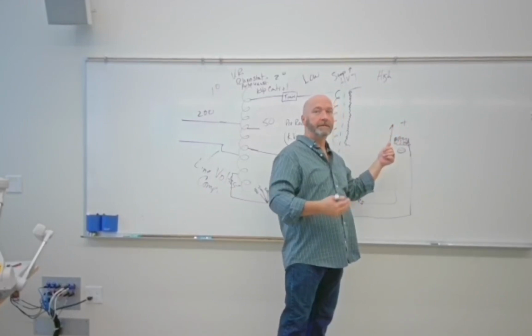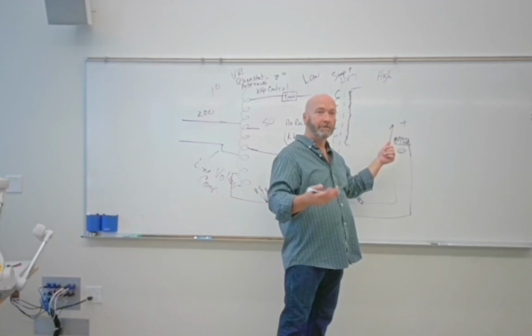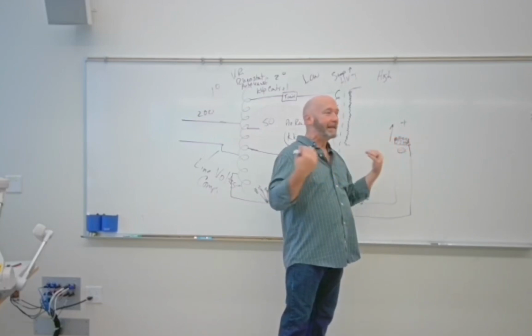It's saturated. You know, if you're a Star Trek fan, as a maintenance guy, is it Scotty? Give it a roll, she's got it, Captain. That's your saturation current. Can't get any more.